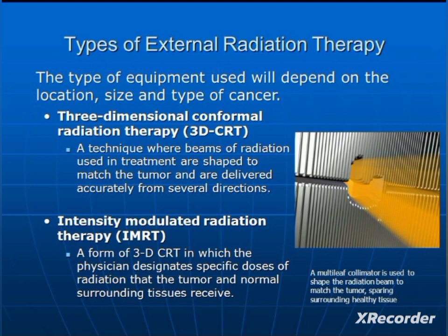Here we are avoiding the healthy tissue. We are only giving radiation to the tumor. Then intensity modulated radiation therapy.